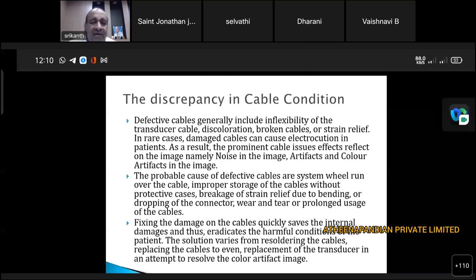But it is a very tedious process because we have to solder 128 wires at the top and 128 wires at the bottom, and you have to correctly check the connectivity and continuity, which pin number refers to which. It's a big process, but we can do that. Next slide, ma'am.